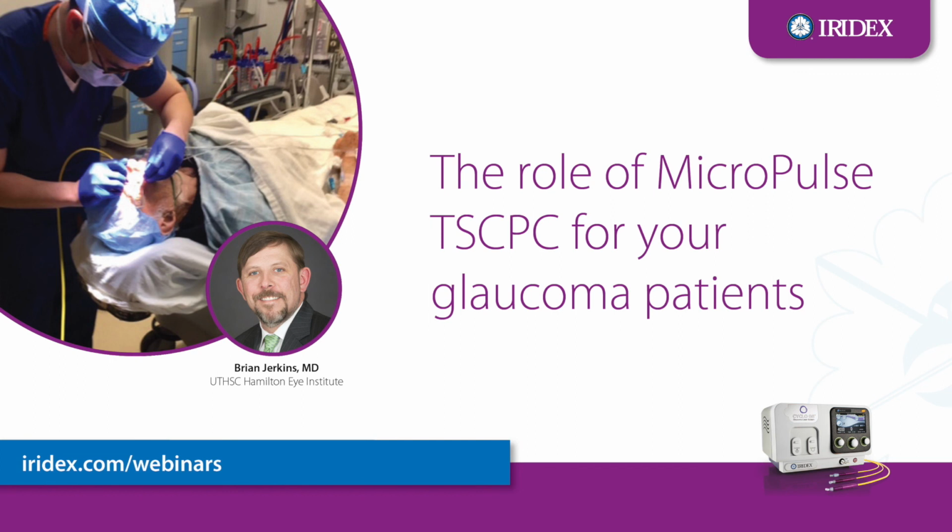Okay. Have you ever seen patients develop significantly slow to clear SPK post MicroPulse? And could this be an effect to the corneal nerves, the limbal stem, or another mechanism? And are there any good techniques to minimize this effect? Yeah, I think this is definitely one thing that I have to work on and am conscious of when I do these surgeries. And a lot of these patients that I try to do the surgery on are already patients who have dry eye issues.